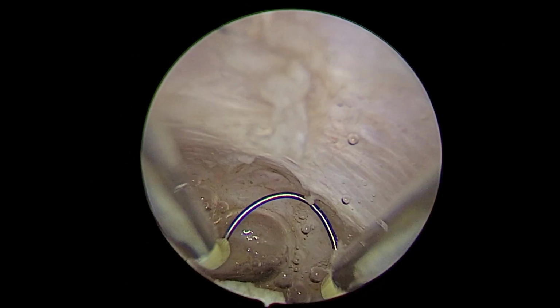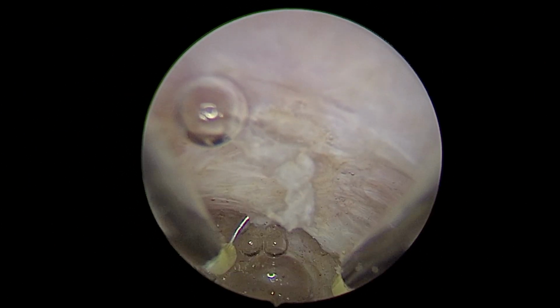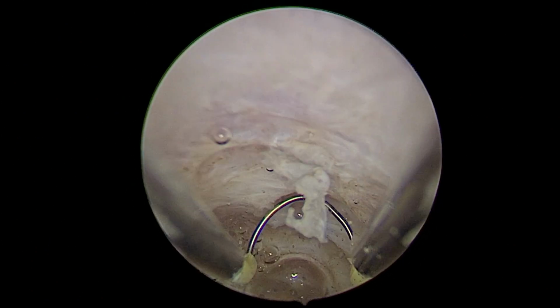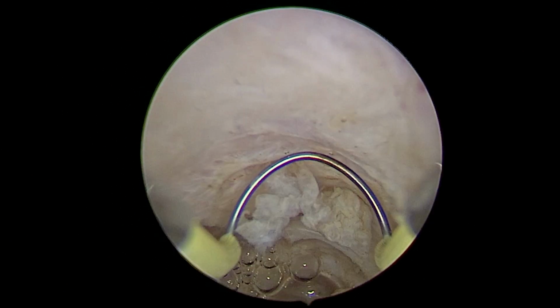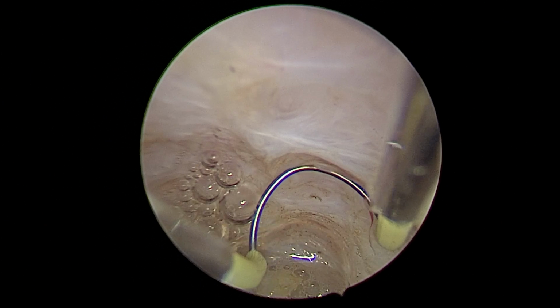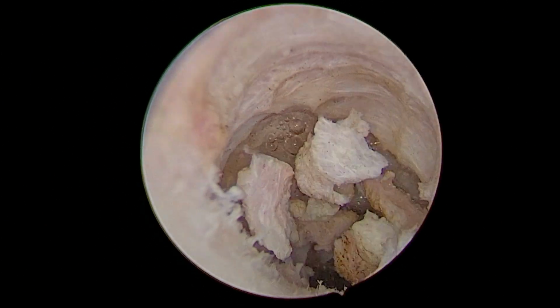Now here again there is one more bleeder. You can see a very small piece of the tissue is excised, and then we go in. Once it is out, notice the backhand movement as well. This is the backhand movement. Then there is a bleeder here. We can see a very small vessel which is coagulated.